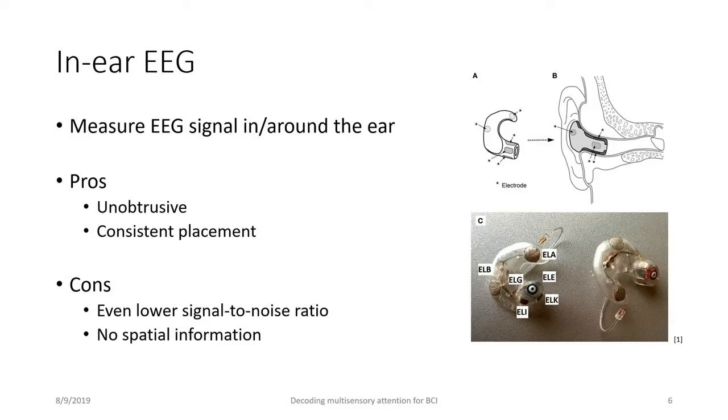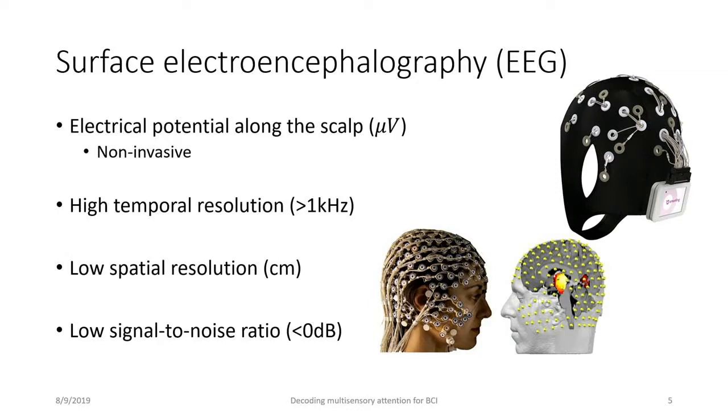So what we usually do for a neuroscience study, thinking about this low signal-to-noise ratio, a single trial doesn't mean anything because we may hardly see anything at the single trial level. The way we do neuroscience with EEG is to collect multiple trials of a single condition and take the average of them, with the assumption that any brain signal corresponding to this stimulus is time-locked. So if we take the average of all the trials we have, then probably the noise will cancel out each other and the signal itself will stand out.